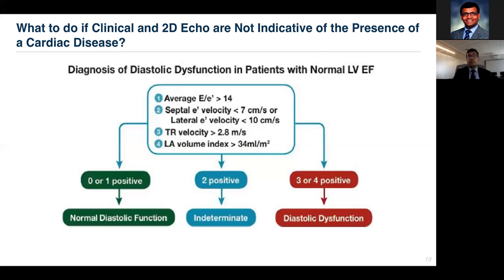Many times you may be able to get an estimate of the TR peak velocity using these additional measures like saline injection, or trying to get a whiff of TR velocity at peak exertion. So the consistency of information is important, and not relying on a weak data set is very important. Do not be afraid to call it indeterminate or to ask for more help, which is the right thing to do, particularly if the clinical situation is still ambiguous.